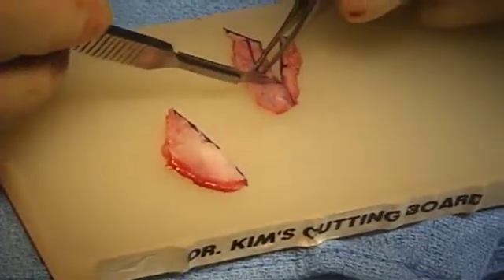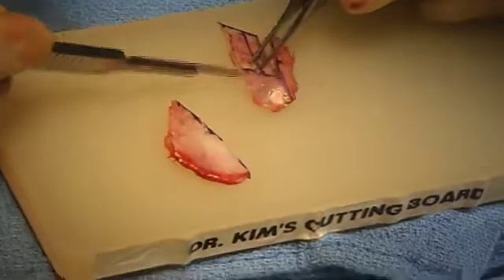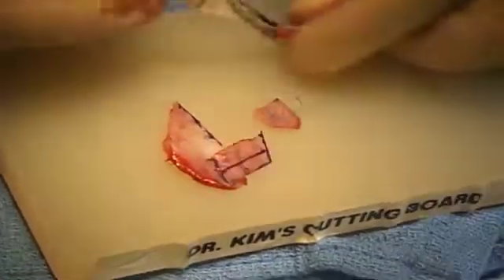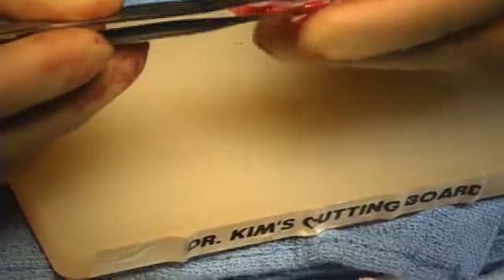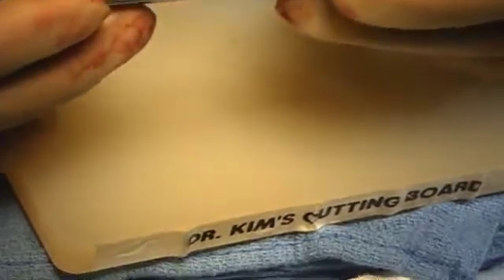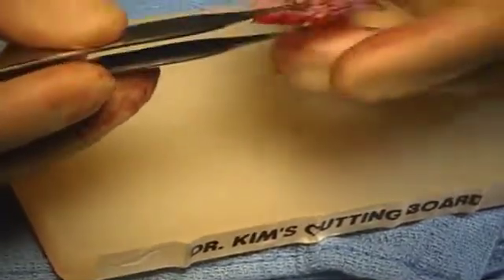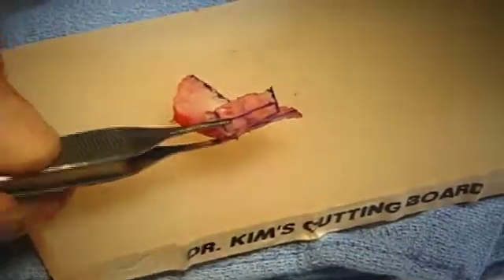The grafts were cut into the proper pieces, including a large splinting graft, a flanking spreader graft on the opposite side, and the caudal septal reconstruction, which would replace the angulated caudal septum.